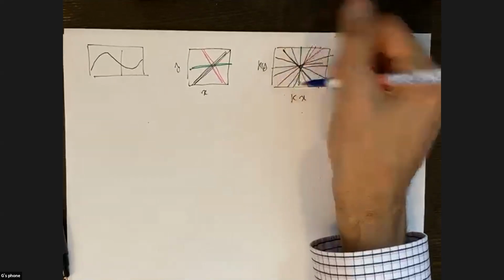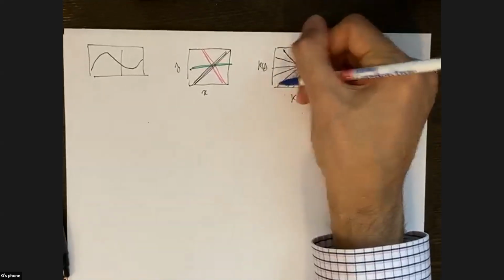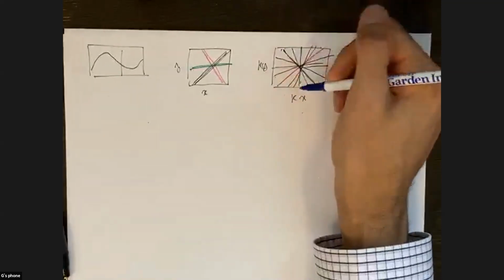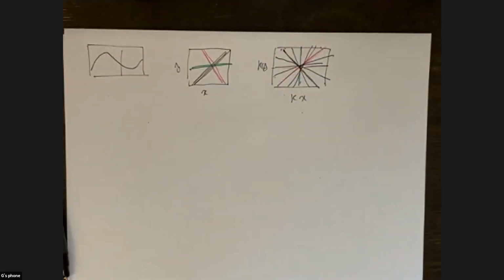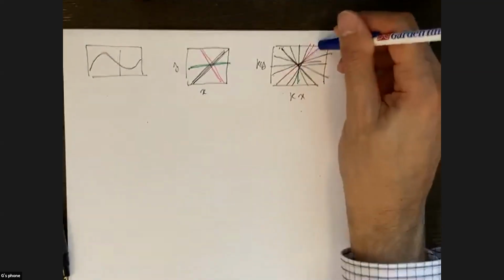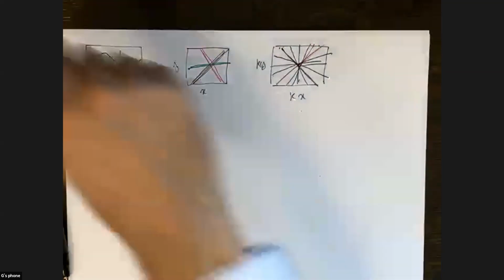Whereas the high frequencies only get sampled maybe once at best, or sometimes not even sampled. And so this creates an imbalance between the low frequencies that get sampled many times and the high frequencies that get barely sampled by the process.